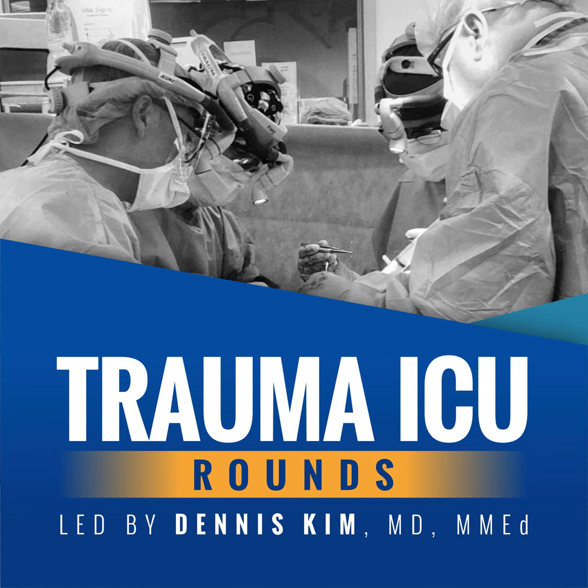Oftentimes, when patients become hypoxemic on positive pressure ventilation, the knee-jerk reaction I've noticed is to just crank up or dial up the FiO2, which isn't necessarily wrong, but I do think that increasing the mean airway pressure is nice, as higher concentrations of oxygen can be biologically toxic. With that said, one important point to bear in mind is that the mean airway pressure correlates with the hemodynamic effects of positive pressure ventilation.